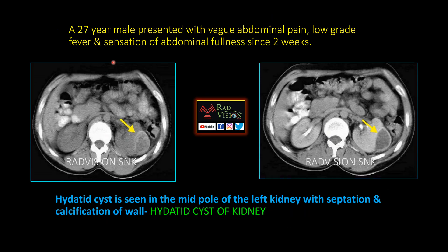Next case: a 27-year-old male presented with vague abdominal pain. You can see there is a cystic lesion with eccentric rim calcification arising from the mid pole of the left kidney. On IV contrast, you can see peripheral rim enhancement. This is a hydatid cyst in the kidney.